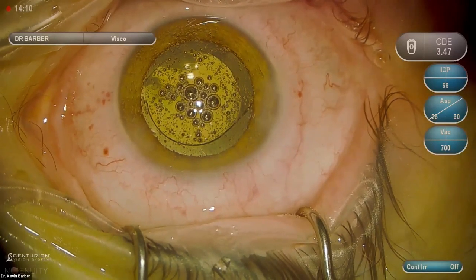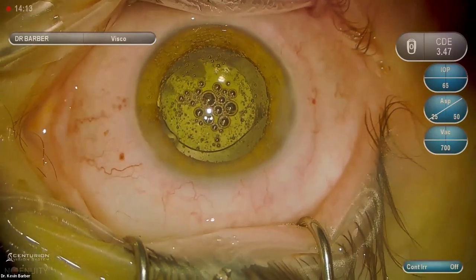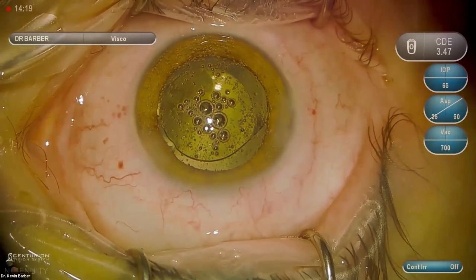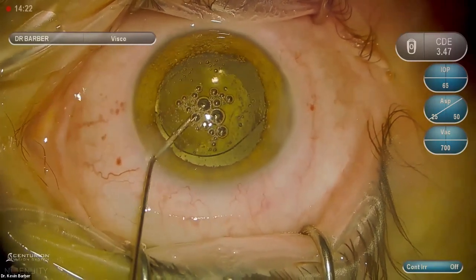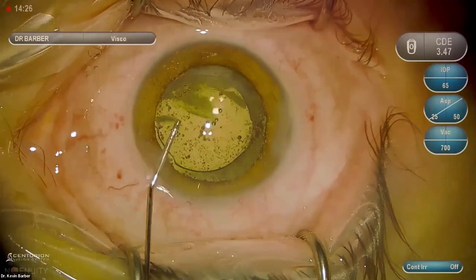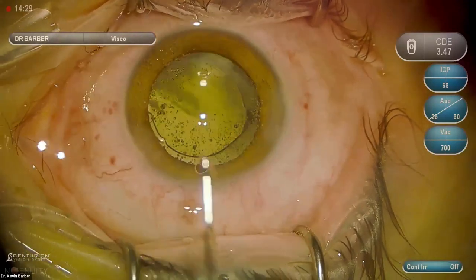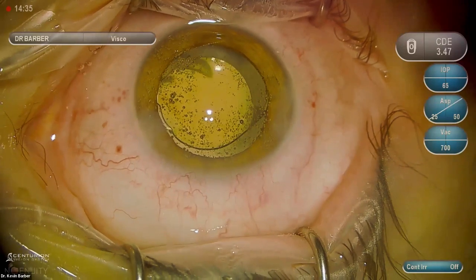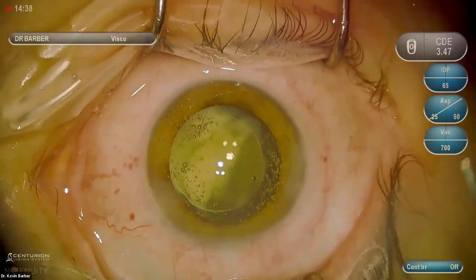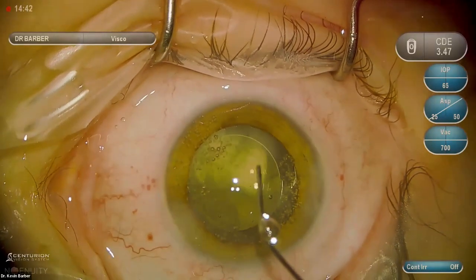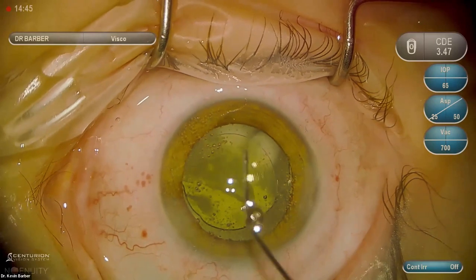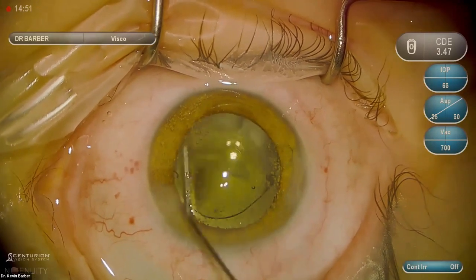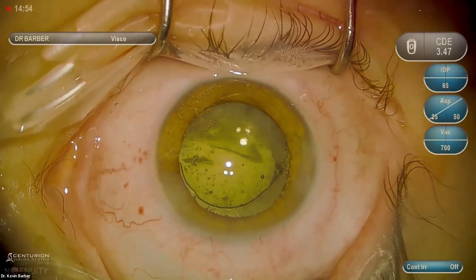I use a Zeiss Lumera microscope with three light bulbs visible as Purkinje images. I have the patient fixate on the center of those three light bulbs, then line the Purkinje images up onto the center of the IOL. If you can look up at the three light bulbs and look right between the three of them, the center of the multifocal lens ends up right beneath the Purkinje image. I've found that to be a no-cost, easy way to get really good IOL centration.